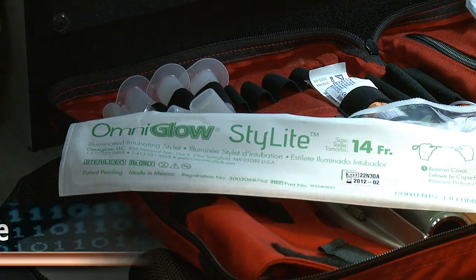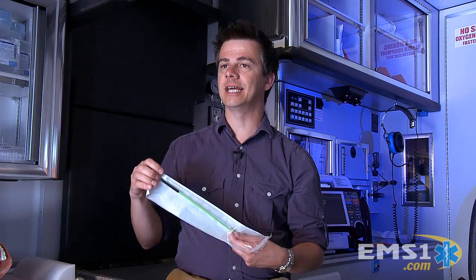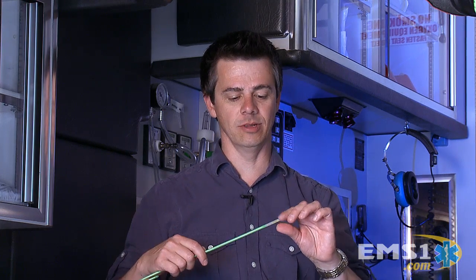But the Omniglow Corporation has come out with something called the Stylite. This is very cool and very innovative. It is a stylet and it comes prepackaged. The nice thing is it has a little bit of protection at the end — it actually is a glow stick. You can pull it out of the package and leave the little end in there so you don't mess with it or lose it. I always like to keep my scenes clean, so having it in there is fine and you don't leave it behind.